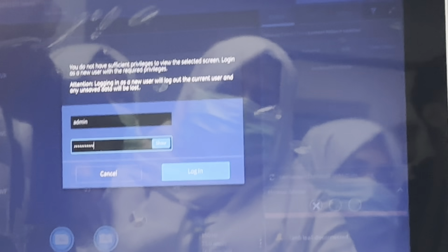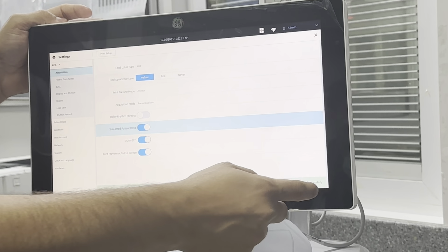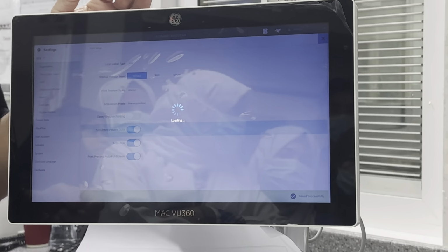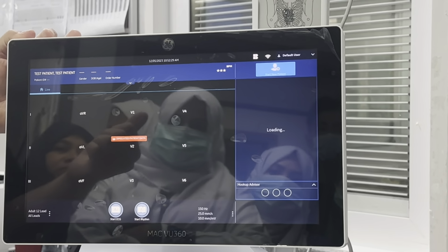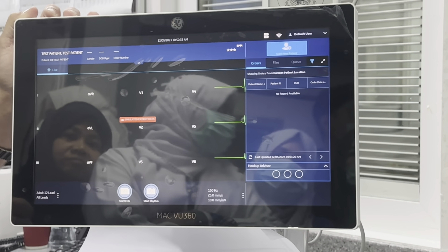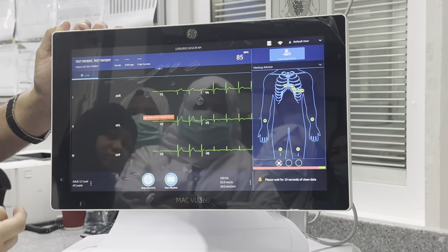When we search the patient ID number, it will retrieve it from the health information system? Absolutely. It will bring it from the health information system with the order placed over there. And even the first time, we just need to do so. Absolutely. Okay, so now let's imagine that we did attach our patient here.